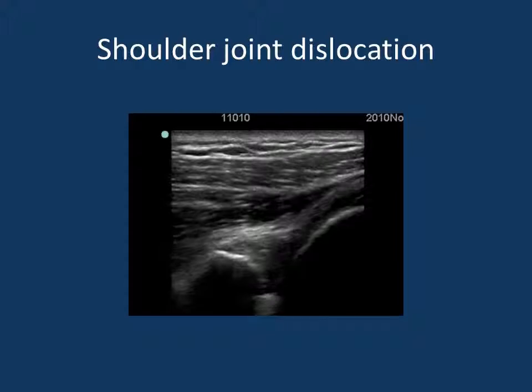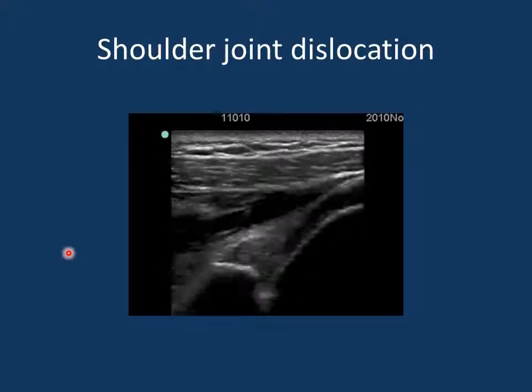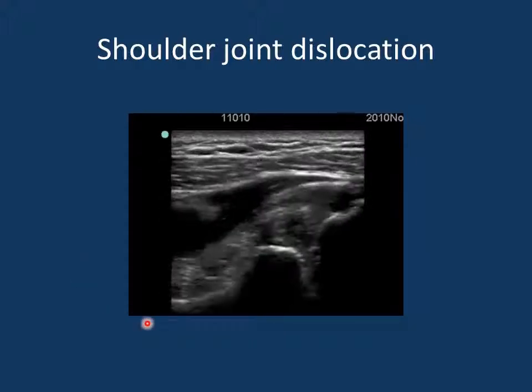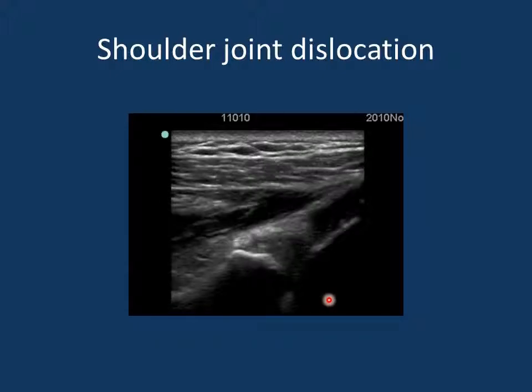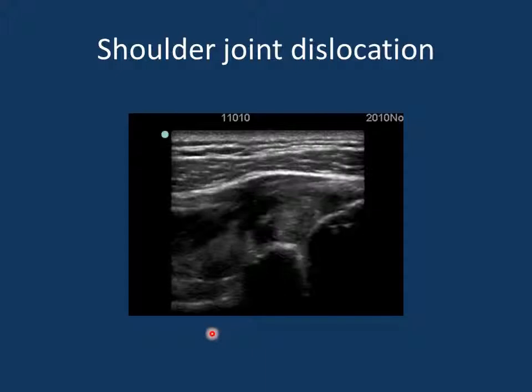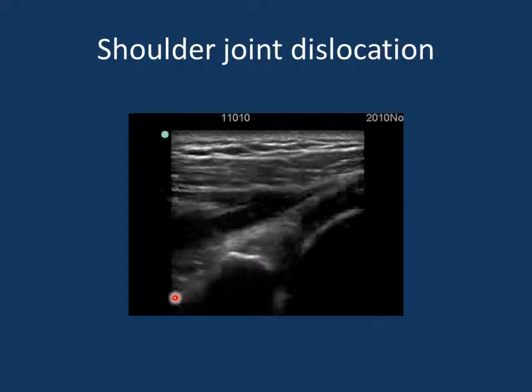Here is another example of some strange discoveries with the ultrasound, and this is a 74-year-old man with left shoulder pain for 2 to 3 years, and he had a history of rotator cuff surgery about 15 years ago. He was sent to me by his buddy, who told him to go to my doctor who is going to give him a shot. So he came to me requesting a shot.